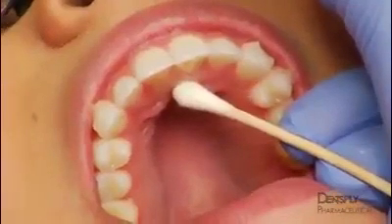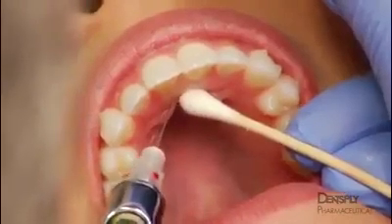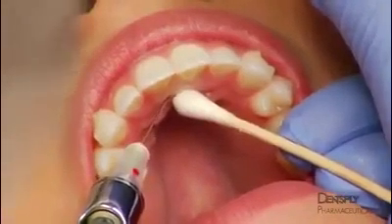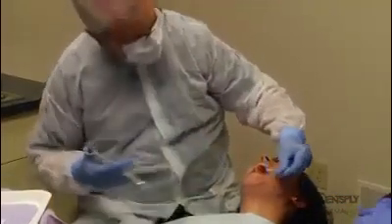Insert the needle into the previously blanched tissue at a 45-degree angle to the palate. Advance the needle until the maxillary bone is contacted and then the injection is administered. Aspirate and slowly deposit 0.45 milliliters of solution, about 1/4 of the cartridge, over 20 to 30 seconds.